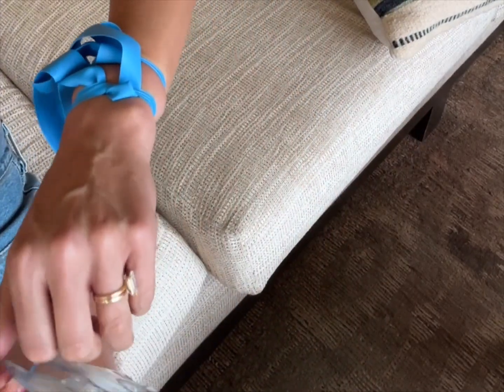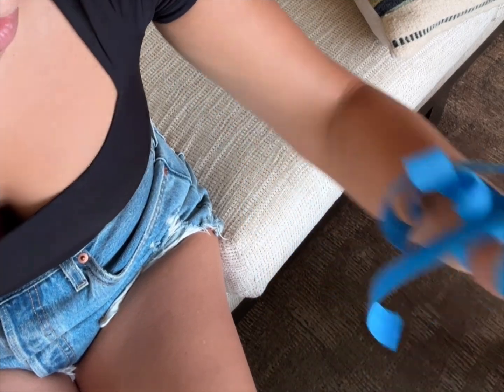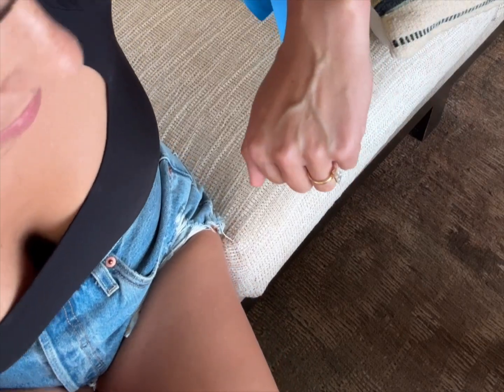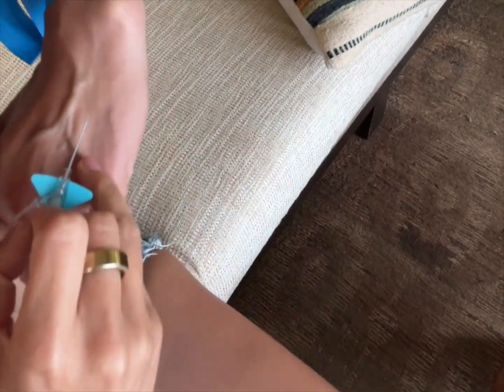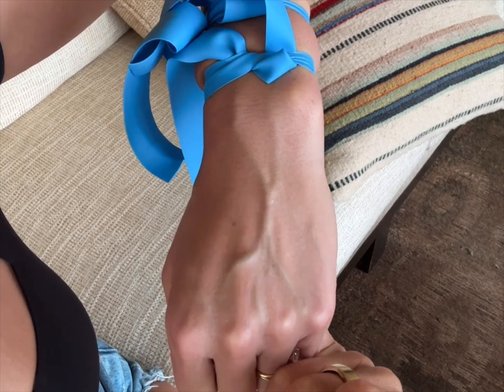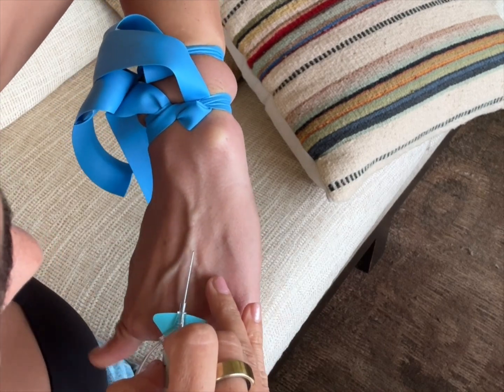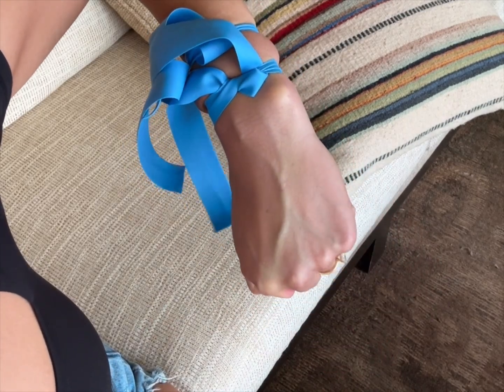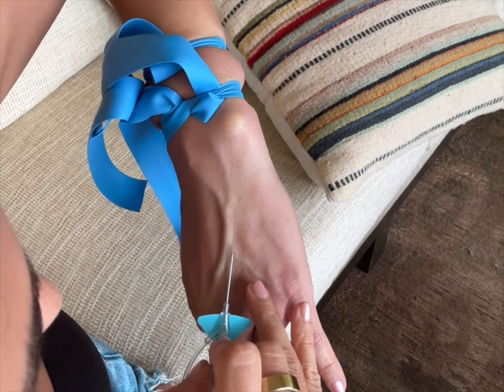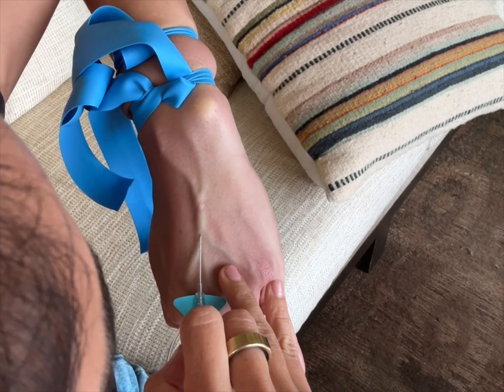We're going to go right there - choosing a size that makes sense. I also don't ever have patients bend their hand back like this; if anything, put your hands under their fingers and pull back. Notice with my thumb I'm pulling the skin down to make the vein more straight and taut. I'm playing around with it to find the best angle - it's going to be right here.